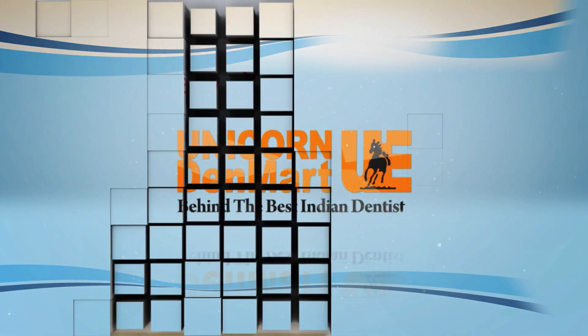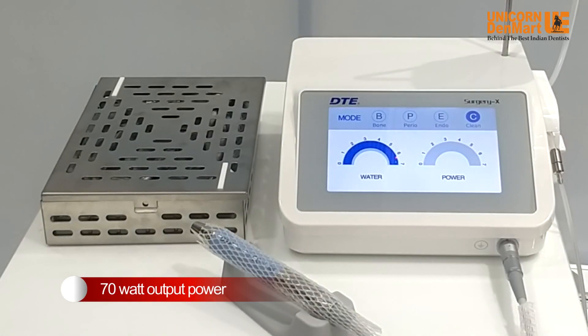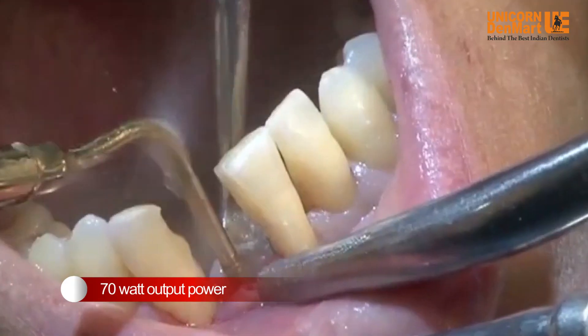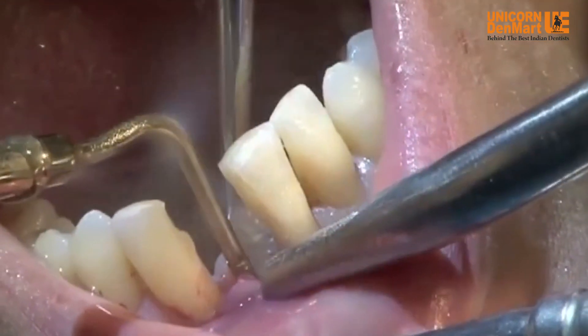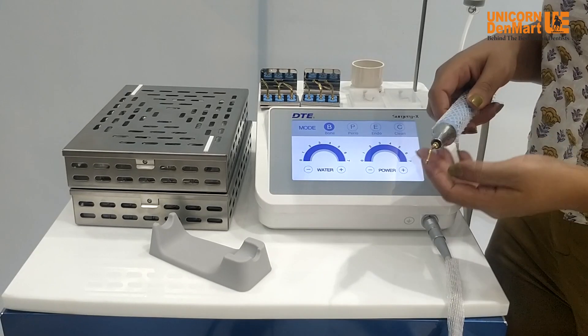Introducing Surgery X, the third generation piezo surgery unit brought to you by Unicorn Denmark Limited. With an output power of 70 watts, Surgery X cuts bones painlessly without damaging soft tissue, with minimal bleeding during operations.